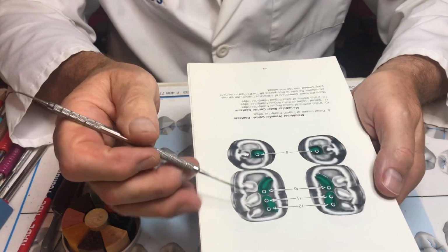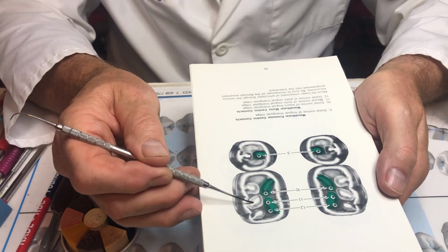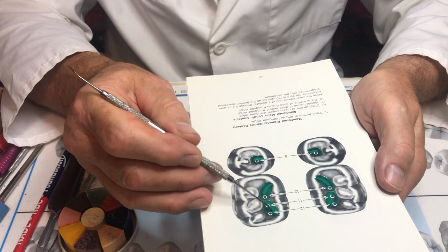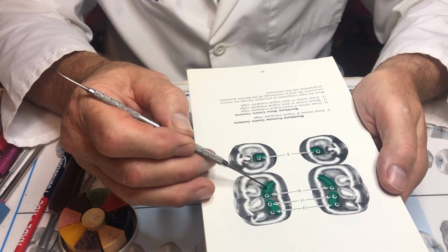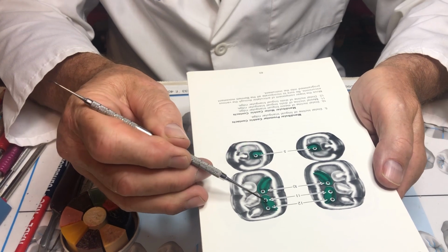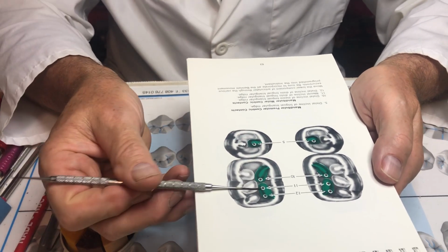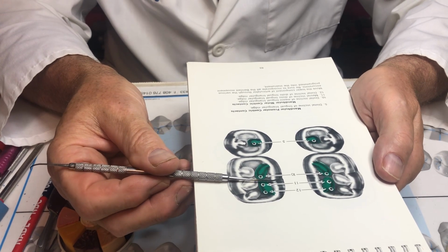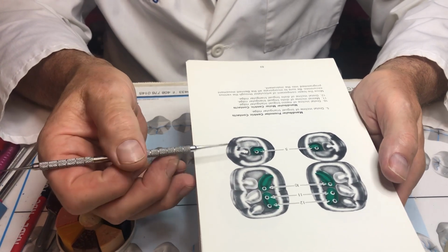Next page shows the lingual side. So here we were just looking at the buccal. You notice they all tend to lean in towards the middle. You look at the two linguals, one comes in and curves to the center. The other one comes in, two contacts, curves to the center. You're so used to making transverse ridges, that's a problem, because now if you try to do that, it's not going to work.